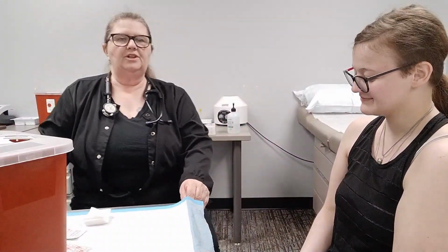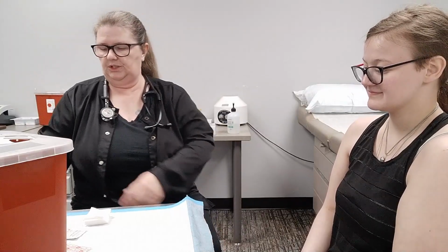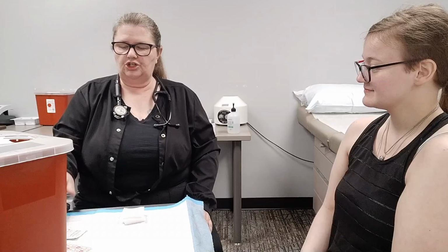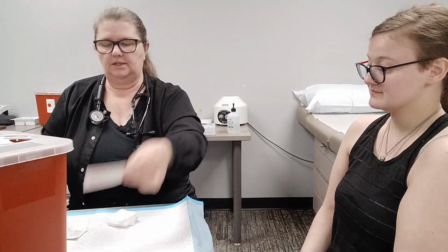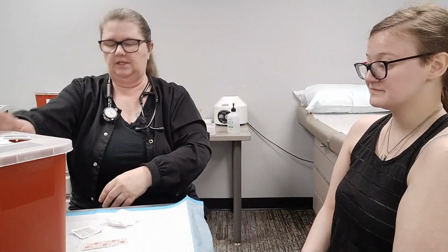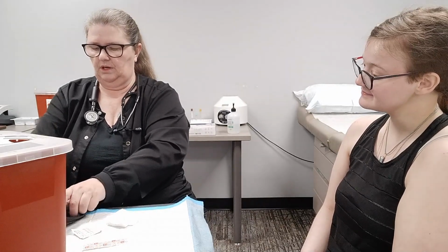Hello, today we are going to demonstrate a glucose test, or a blood glucose test. Before we get started, let me just go ahead and show you what we have here. We have some 2x2 gauze, a Band-Aid, an alcohol swab, a sharps container, and our glucometer.